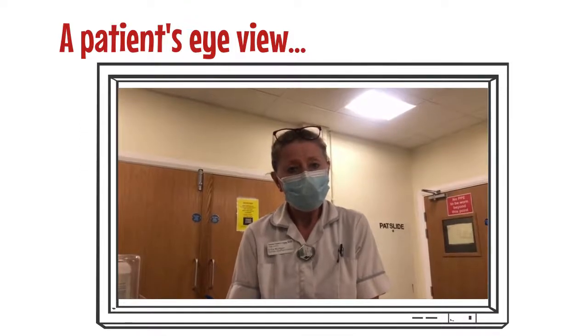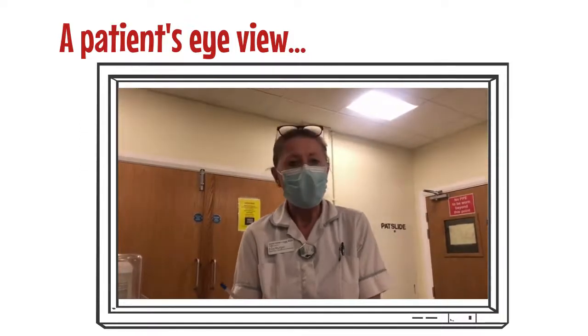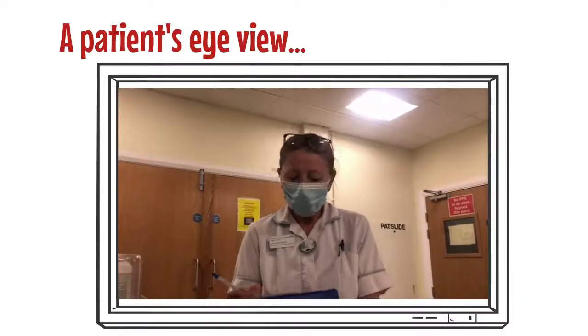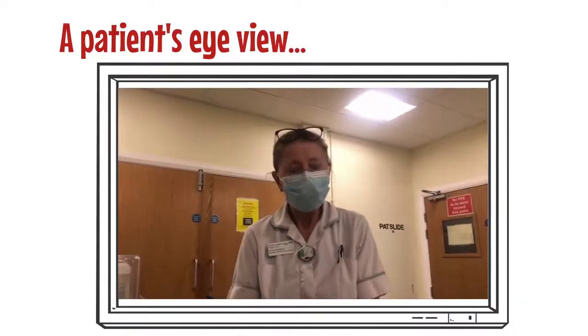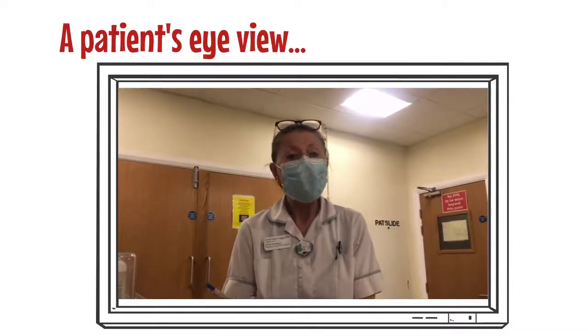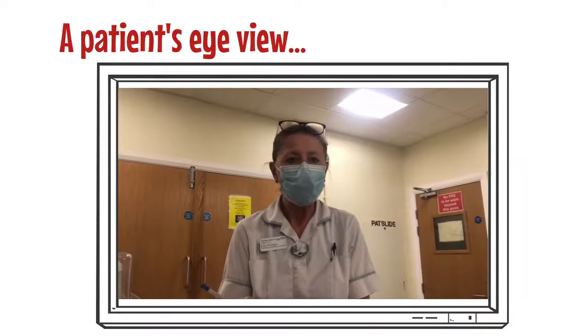You may also be asked if you could be pregnant, if you are of childbearing potential between the ages of 10 and 55 and if your scan is going to include the abdominal area. It is important if you could be pregnant that you tell the radiographer before the scan happens so that they can ensure that it is the right scan for you and the baby.